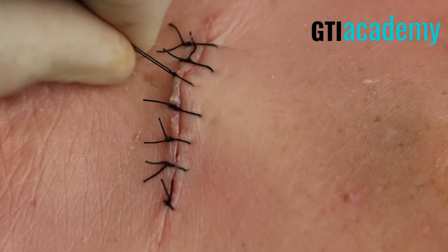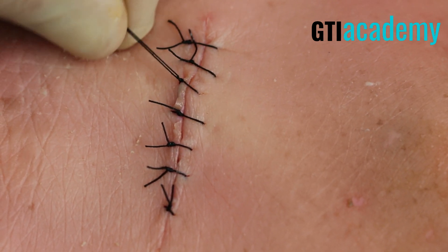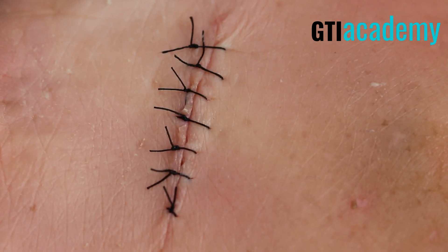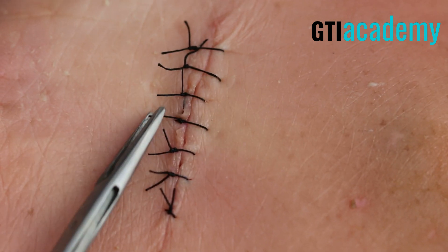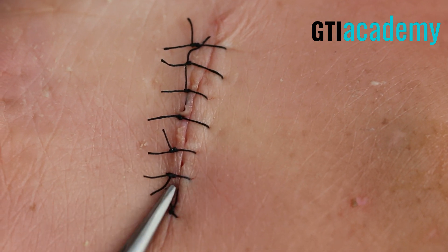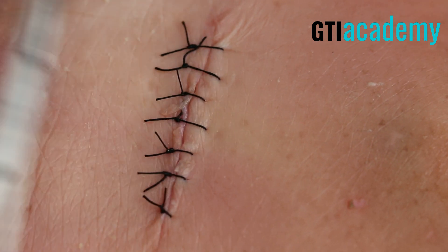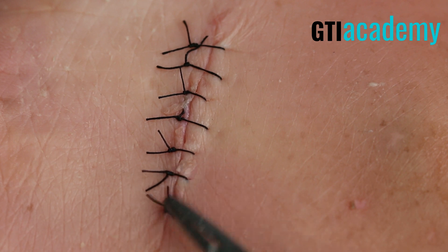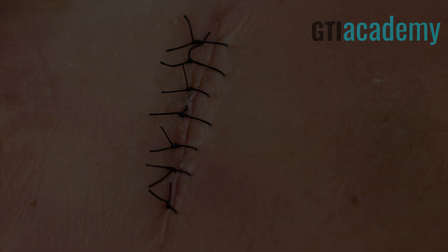Nice and approximated. Notice how equal those free ends on each of the individual sutures are, and also how all the knots are tied on the same side. A little fine tuning here — I'm really looking for approximation of the wound and the sutures all look very nice. Let's complete the simple interrupted suture.